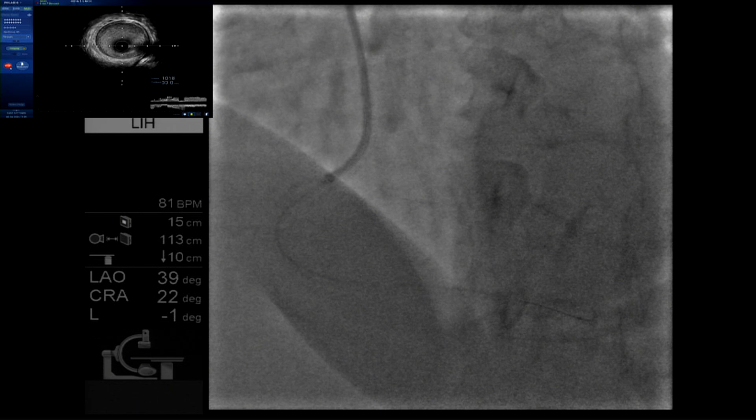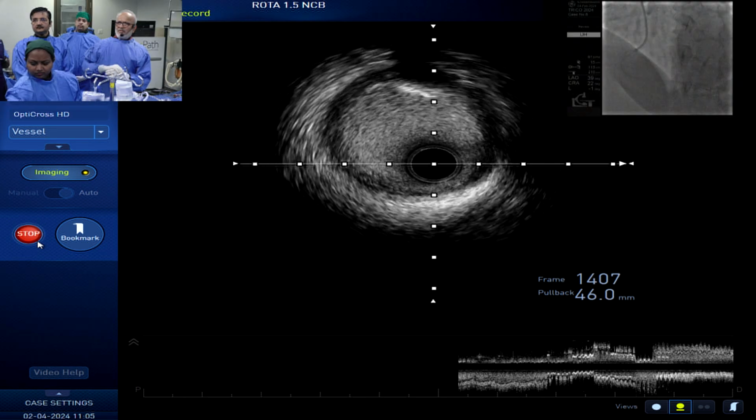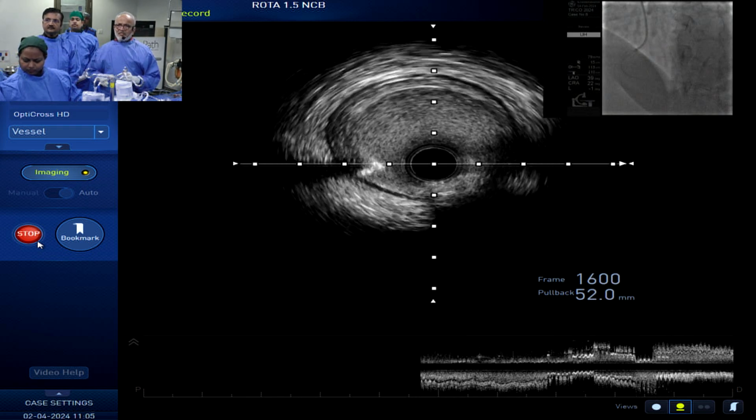So my question to you is, Professor, there are so many learners of IVUS here. With OCT, we have a very objective documentation of the thickness of the calcium, whether it is a differential calcium thickness or whatever, and the thickness, length, as well as breadth and everything.